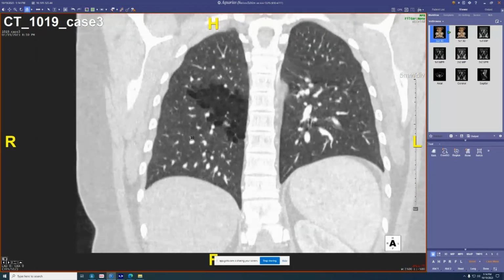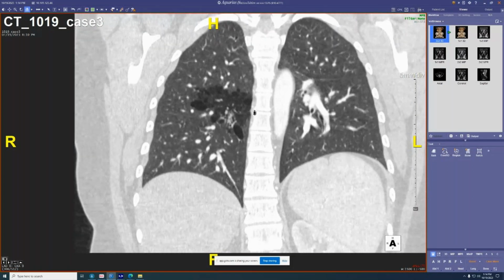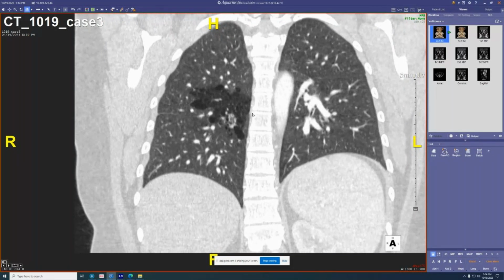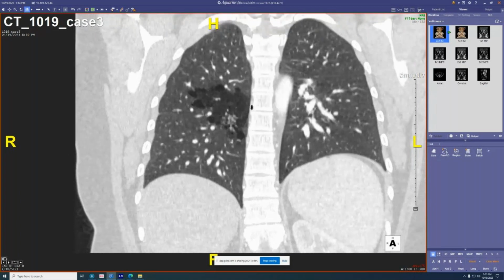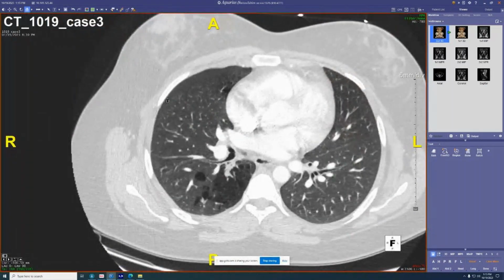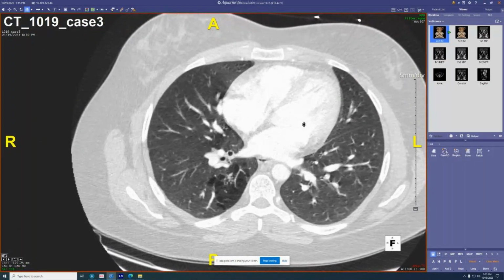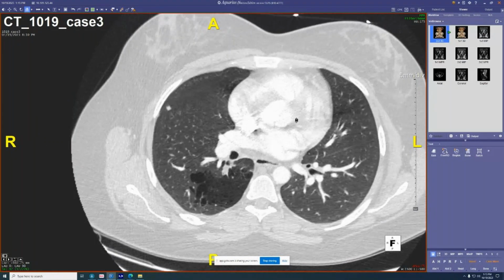Yeah, it looks too not. Anyways, I was just reading that supposedly adenocarcinomas are a common complication of the type 1 CPAMs, but not the type 2 CPAMs. But again, I don't know how confident I am of that diagnosis, just based off the cyst size without pathology. But who knows what they'll do? It's just really a CPAM with bronchial atresia. Anyways, that's all I have.